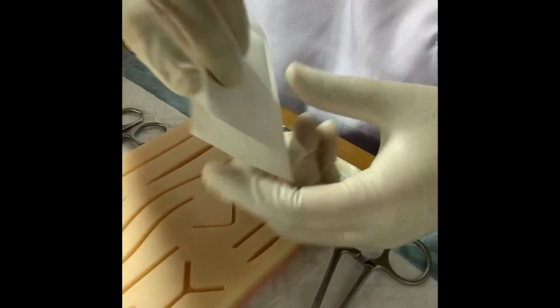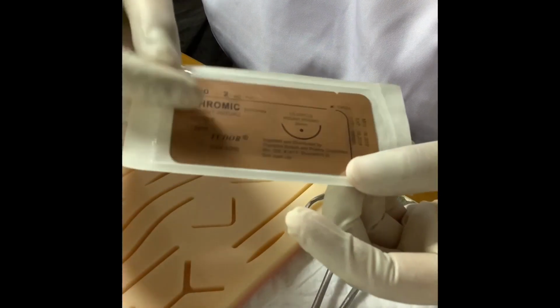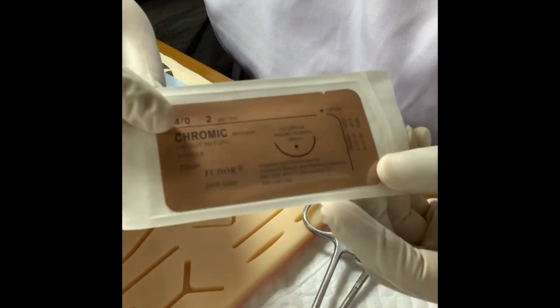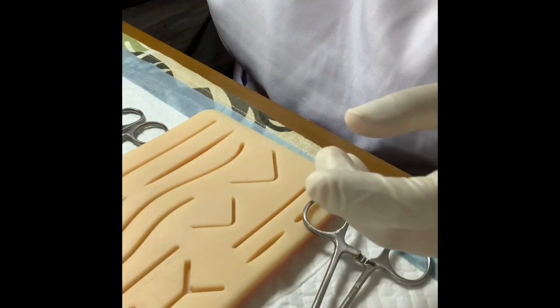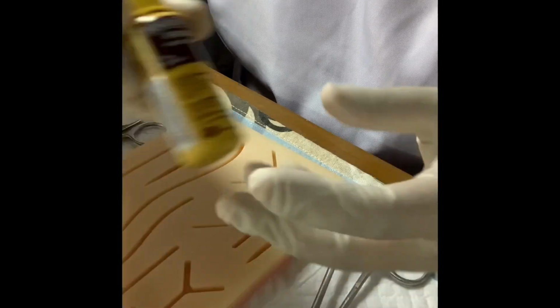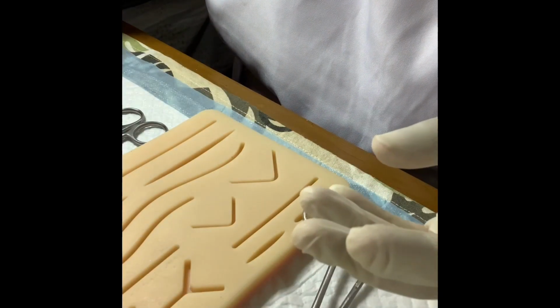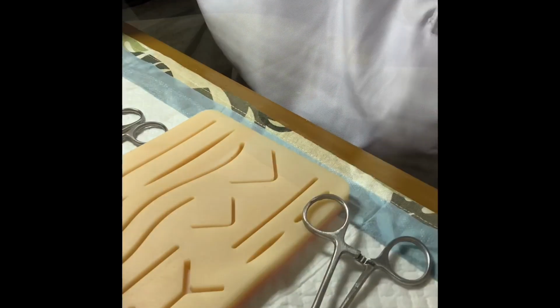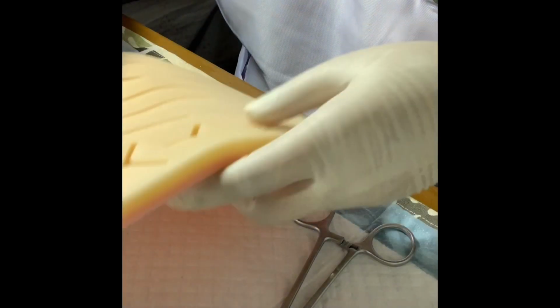For the sutures, you can use different types of sutures for different types of wound. And for today, I will be using a 2-metric chromic catgut sterile suture. Also, we will be using povidone iodine for wound solution, a tape, and a gauze pad. And lastly, we will be needing a skin model or a suture pad.